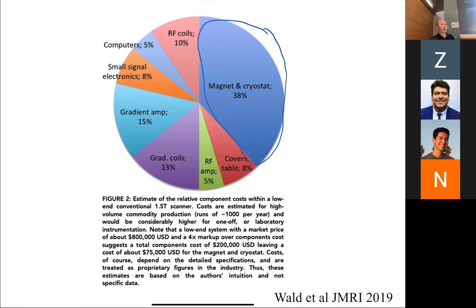So some of the things that people are looking at is, can we reduce the cost of the magnet? And also, can we make it so that the siting cost is not so high? One of the things that increases the cost is if you have a lot of helium, you need to figure out a way, if the magnet quenches or loses its field, you've got all this stored power, right? And you've got to blow off the steam somewhere.